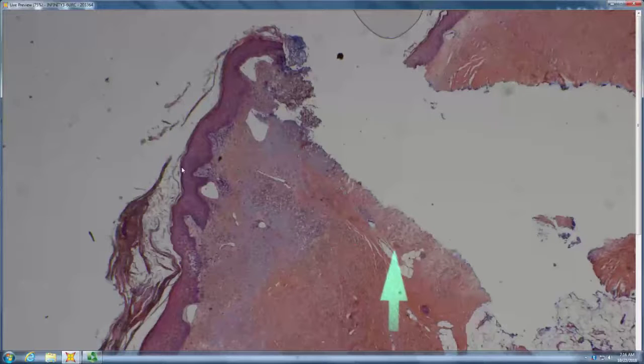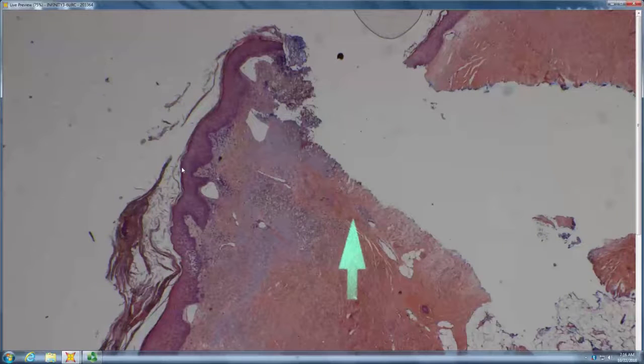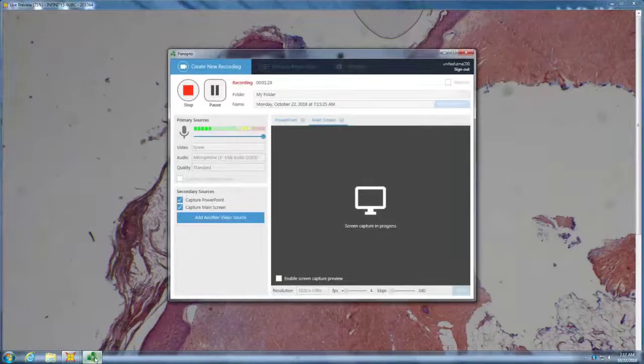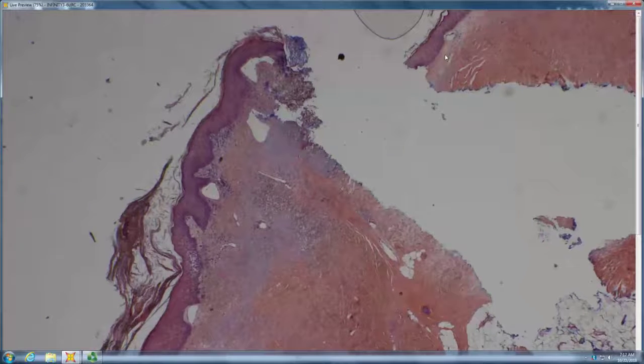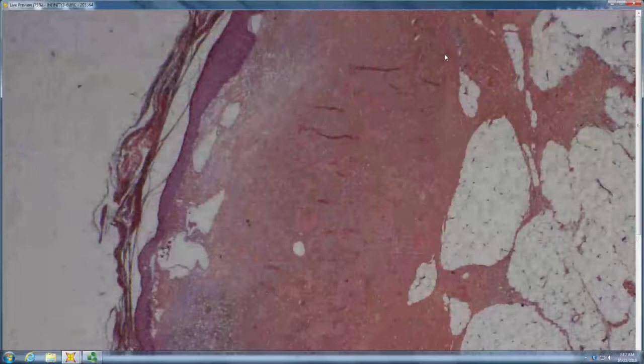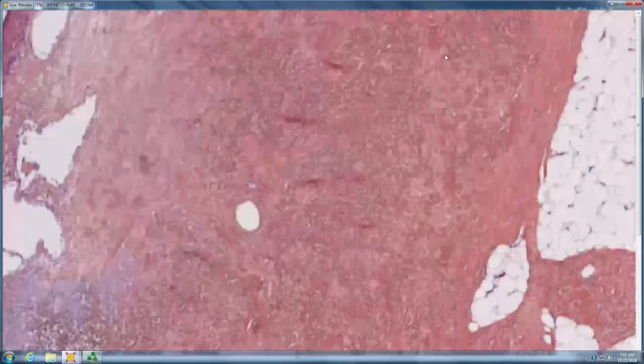And deeper. Yeah, exactly. So it follows the follicular structures. You have vertically oriented elastosis, which is something that you don't typically get with solar elastosis. You don't get it in hair follicles, vertically oriented. Speaking of hair follicles, where are they? Gone. So adnexal structure is largely gone.